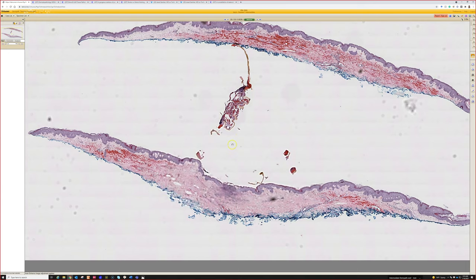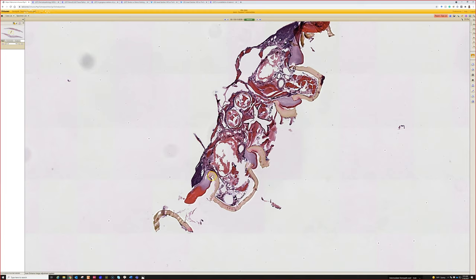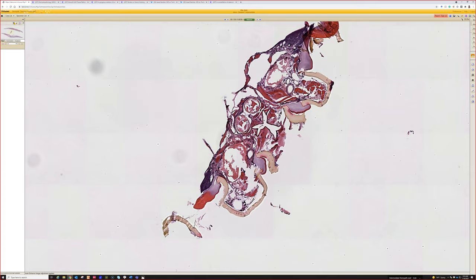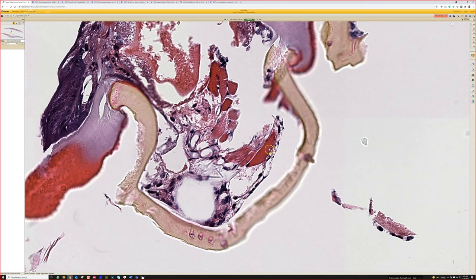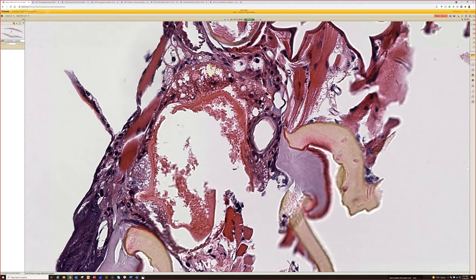Case eleven — I always enjoy when I see these, a rare treat, if you're weird like me and it's unusual DermPath stuff. What is this? A tick. It's not human — this is an arthropod. Look at this thick layer of yellow stuff — that's chitin, which is a carbohydrate-like substance in a lot of arthropod exoskeletons. You can even look into the body of the tick — that's tick skeletal muscle. You can see the peripheral nuclei and even the striations. It's like a world within a world: we're studying human microanatomy and then all of a sudden there's an intruder from non-human origin and you can look at its internal structure.